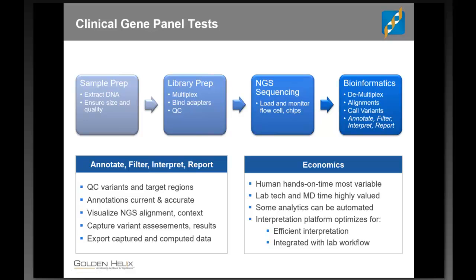So those panels can be hereditary focused, looking for a hereditary diagnostic. They might be also carrier status screening focused or predictive of things like lifetime risk of breast cancer, or they might be focused on characterizing mutations in cancer cells to help inform the targeted therapy of those cancer cells. A lot of solutions out there, and depending on which ones make sense to implement, there are small tests and there's large tests, and the nice thing is you can kind of do something very specific to the institution or the lab needs that you are serving, and there's a lot to go off of with these vendor solutions.